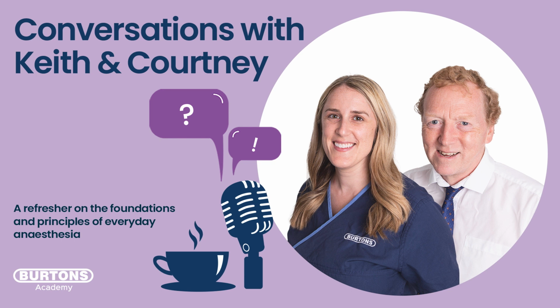I think we need to come back and talk about compliance in a moment. But we're going to put in some flow until we get to that target pressure of 10. Then once it gets to that 10, the ventilator says, I finished inspiration. Let's stop that process, so let's now allow expiration.